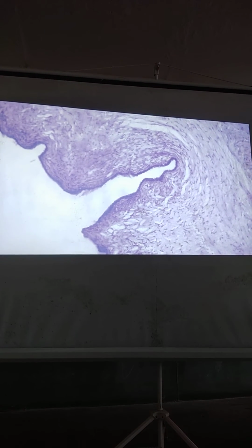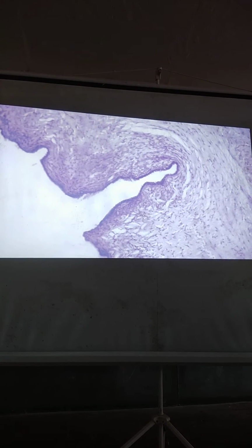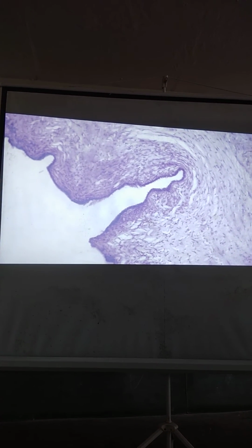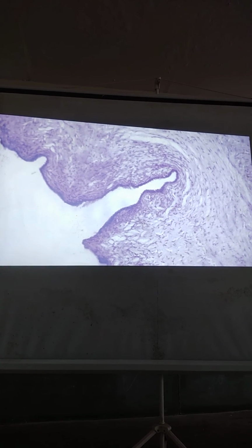For lymphoid lesions and hematogenous malignancies, they have a different terminology, like leukemia, lymphoma. So this is your serous cystadenoma. You identify the cyst, or you label the cyst, according to the lining epithelium. What does it recapitulate?